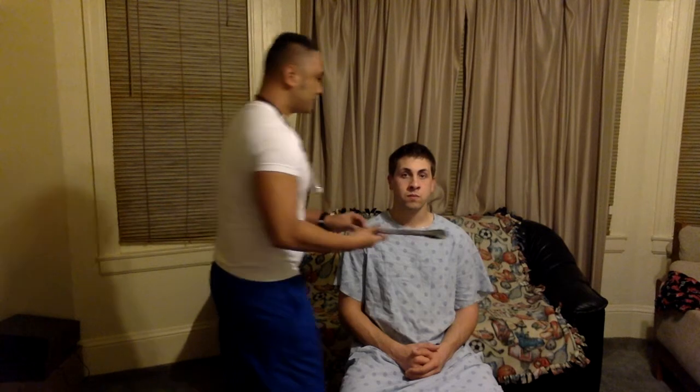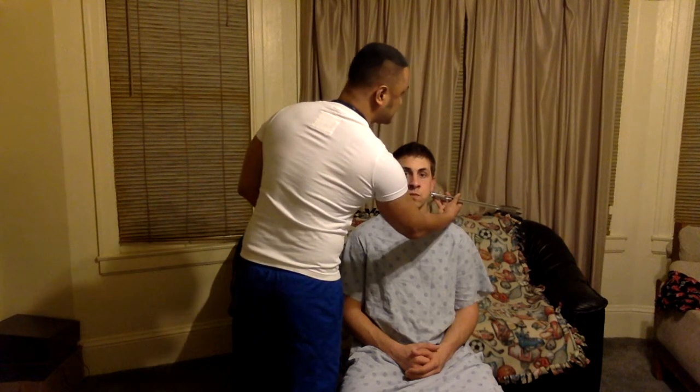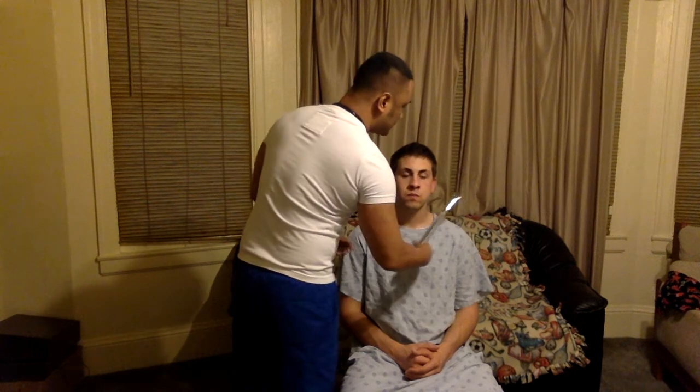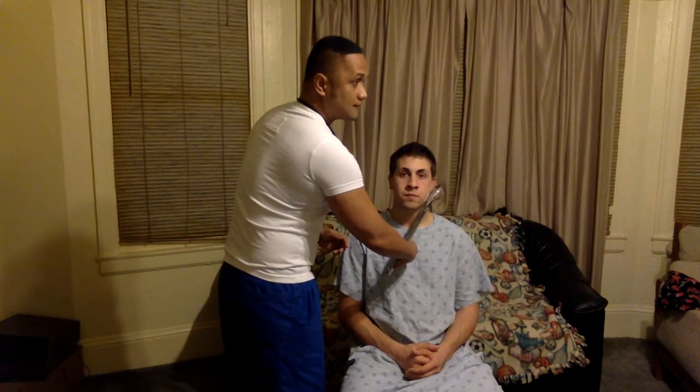So you strike the fork and then put it at the back of the patient's ear until he doesn't hear it anymore. Do you hear it anymore? And then you put the fork closer to the patient and then remove it until the patient doesn't hear anything anymore.